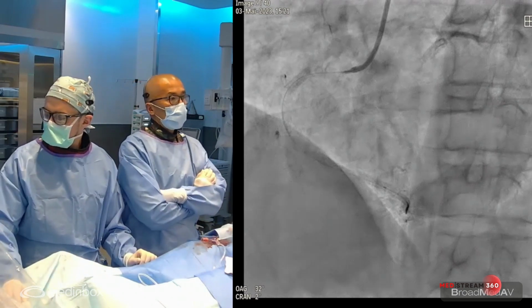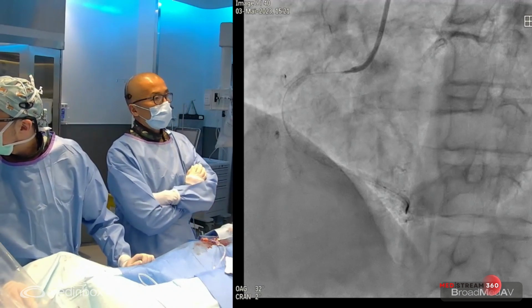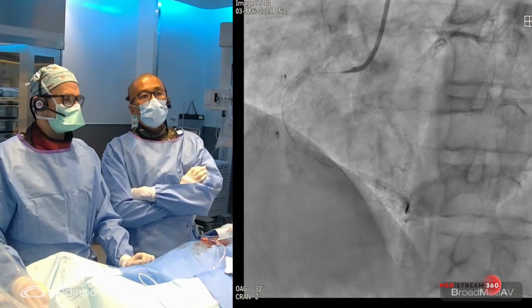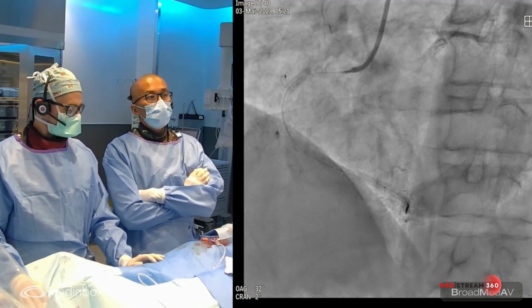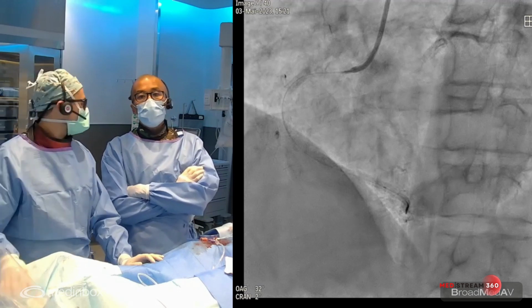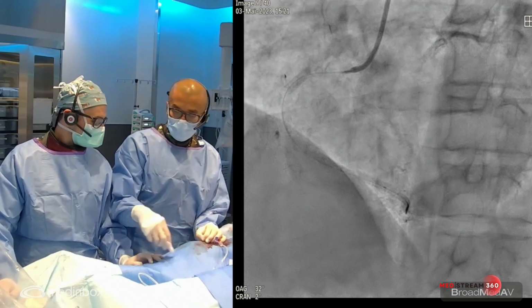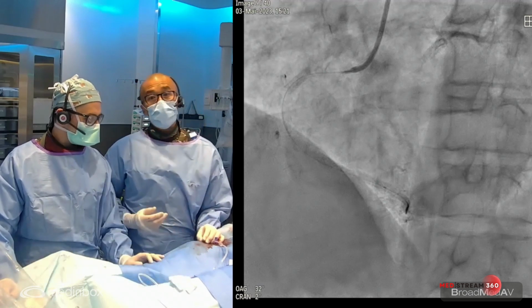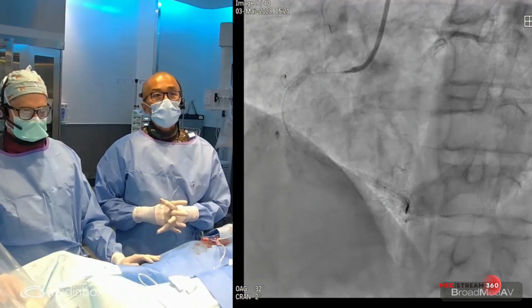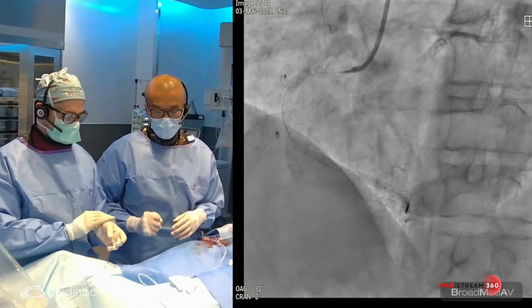There is data out there when you talk to KOLs such as Ziad Ali. He has mentioned there are studies that show that even though we might not necessarily see some fractures on OCT, there might be some microfractures that you could have as well using IVL. But with OPN, ultimately what you want is fracture. So if the IVL is not available, then as a fallback plan, OPN is the next one.